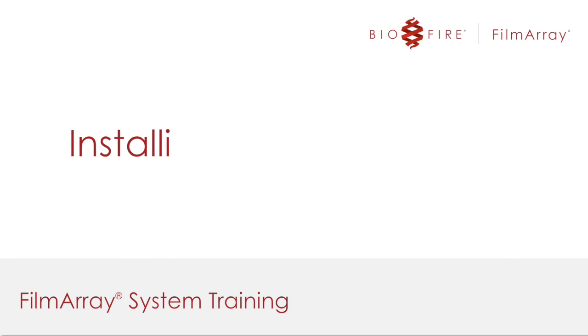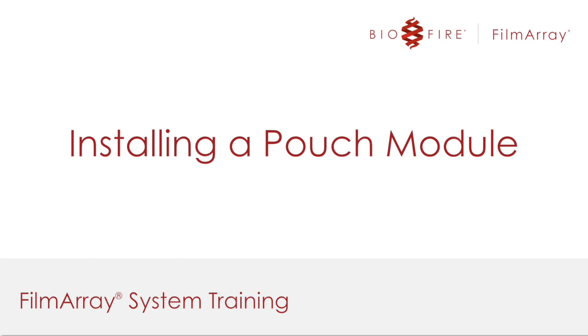Welcome to FilmArray System Training. In this video, I will show you how to properly load a software pouch module.